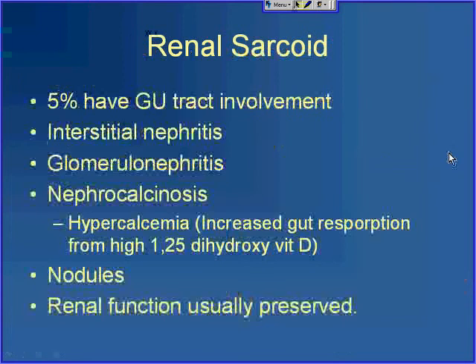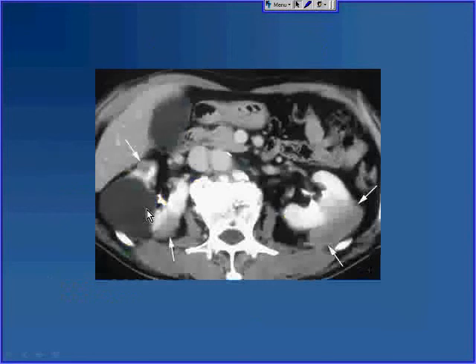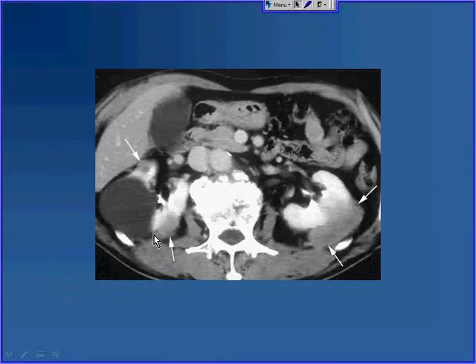A small percentage of patients have genitourinary tract involvement, typically interstitial nephritis, glomerular nephritis, or nephrocalcinosis. The nephrocalcinosis is due to upregulation of vitamin D in sarcoid, leading to increased gut reabsorption of calcium, causing medullary nephrocalcinosis. Rarely, as in the liver and spleen, patients can get renal nodules. These are usually incidental findings because renal function is almost always preserved. This example shows bilateral sarcoid nodules in the kidneys — areas that aren't enhancing as much as the surrounding enhancing renal parenchyma, alongside a simple cyst.